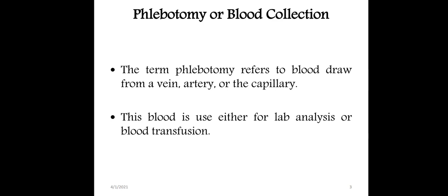Phlebotomy or blood collection. The term phlebotomy refers to blood collection or blood draw from a vein, artery, or capillary. This blood is used either for lab analysis or blood transfusion.